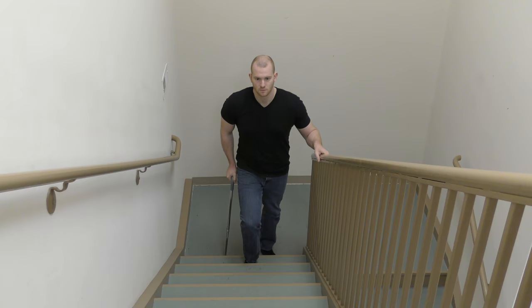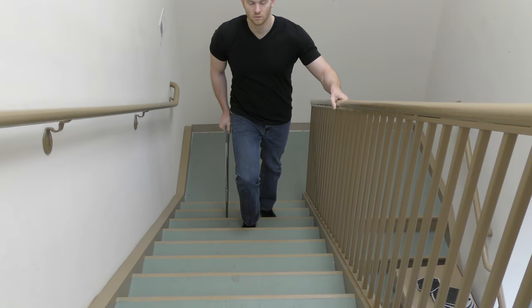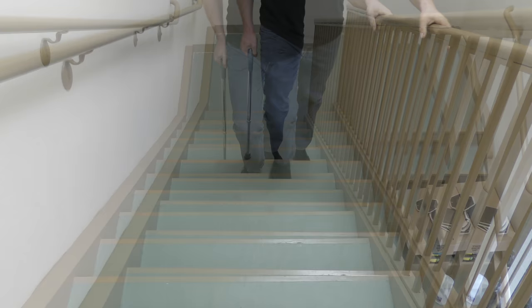Going up the steps one step at a time: step up with the uninvolved side first, followed by the involved side and cane together. Always remember to hold the rail.